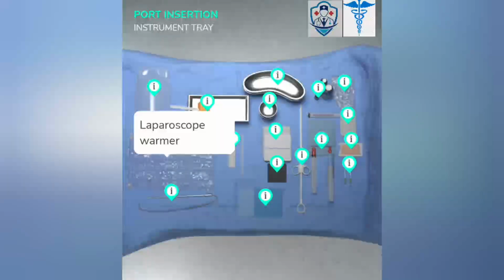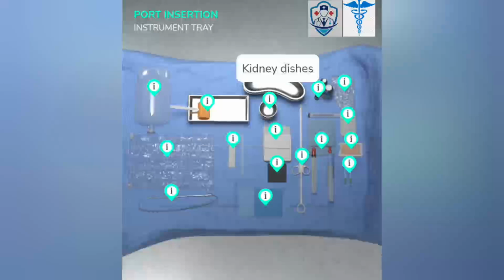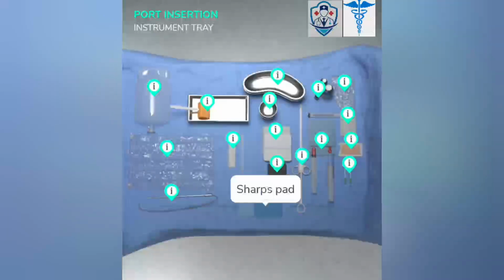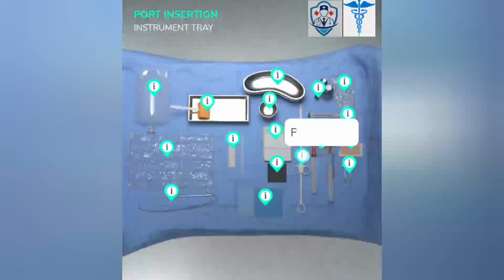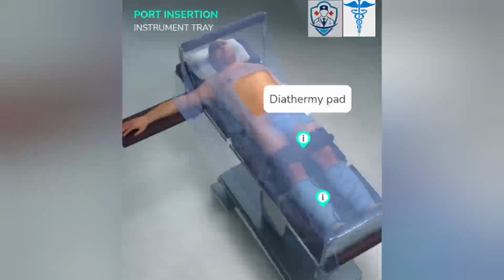An overview of the back table. Here you can see all the instruments named one by one. An overview of a patient showcasing other equipment needed.